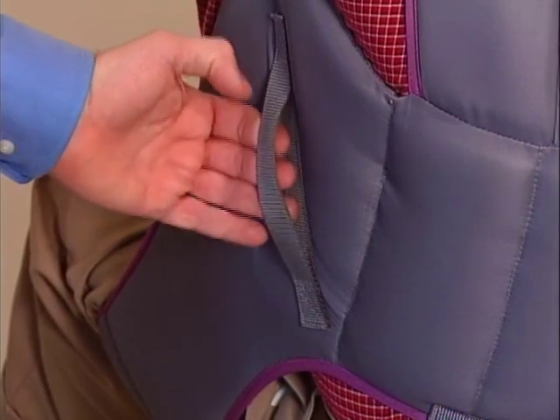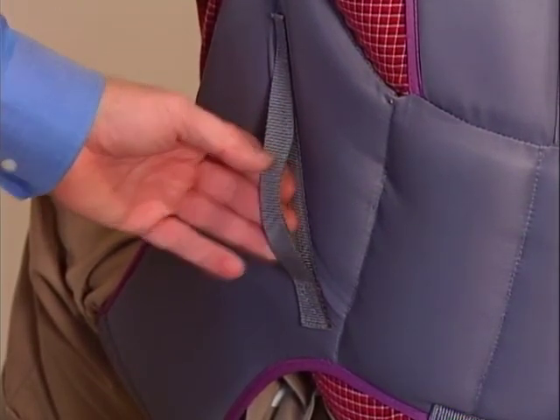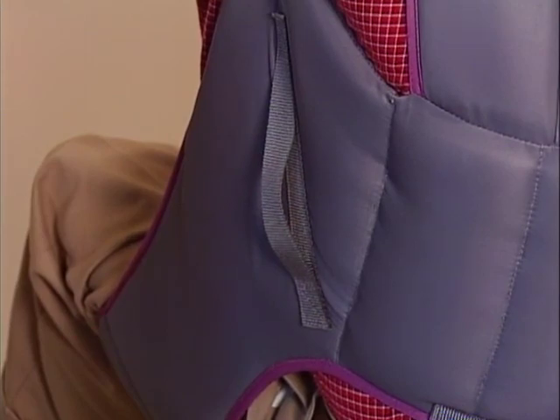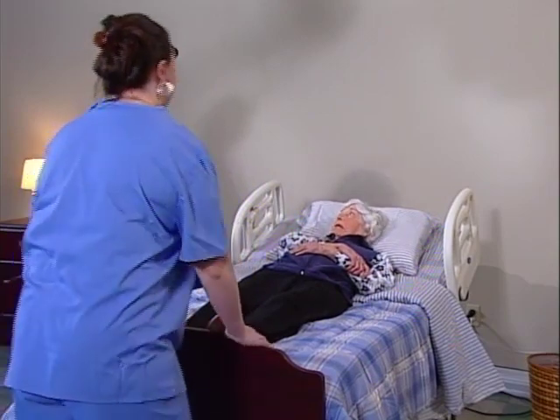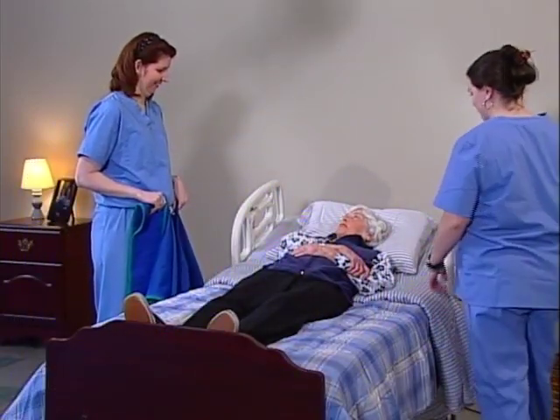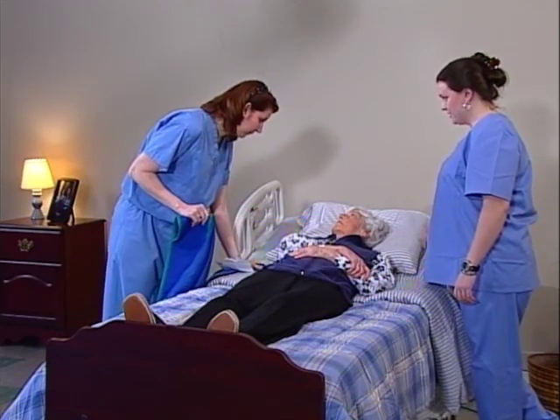Most slings have reinforced grab straps sewn into the back to assist you in guiding your resident. And although Invacare lifts and slings have been designed so they can be safely operated by one caregiver, it's recommended that two caregivers perform all resident transfers. Before you attempt any kind of lift, make sure that you understand the resident's limitations and their ability to assist the transfer. It's a good idea to communicate with the resident throughout the process. If you explain each step as you work through it, your resident will learn the routine and become comfortable with it.